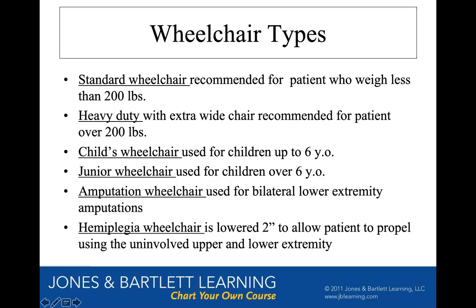Well, there we go. Okay, so there's a lot of different wheelchair types. We'll go through these super quick because you can read it and it's self-explanatory. A standard wheelchair is going to be that middle picture of the three wheelchairs I showed y'all. That's just the basic standard wheelchair you see most hospital patients being wheeled around in. They're foldable, they're heavy, have a leather or vinyl backrest and a sling seat. Usually holds people 200 to 250 pounds. It's just called a standard wheelchair.